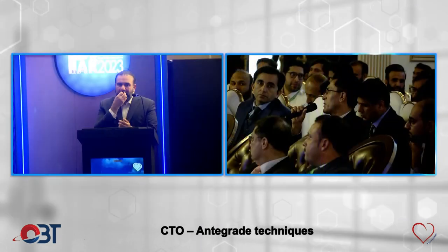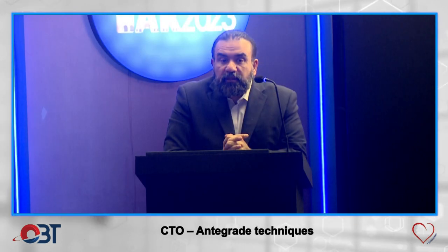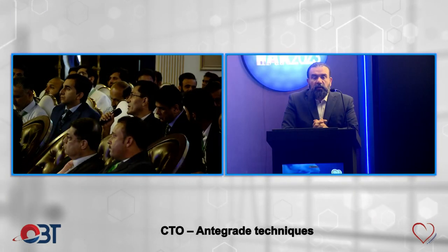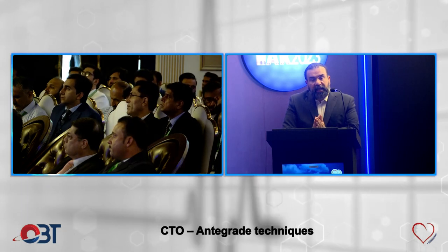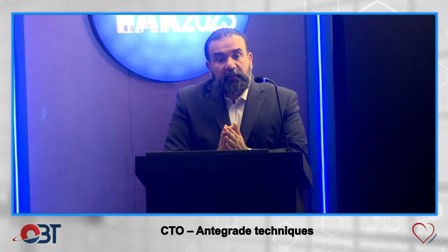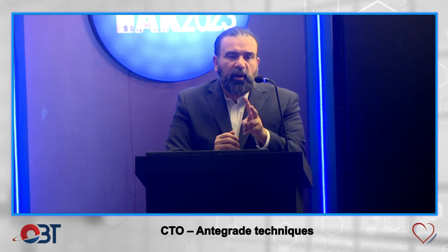And one very simple question, because I'm not sure, we've not been using this Carlino technique. Your wire preference in cases, I mean, always when you get such case, you want to go using Carlino. Your wire choice, generally. So generally to probe the cap is usually Fielder XT or maybe Hulky Pilot, maybe Pilot 50 or Fielder FC. But if I have to puncture the cap, I typically use a Gaia 2. And after the Gaia 2, I will take the same soft tip wire I was using before to probe, Fielder XT or FC, to see if I can go through that. So between two wires, you should be able to do it.